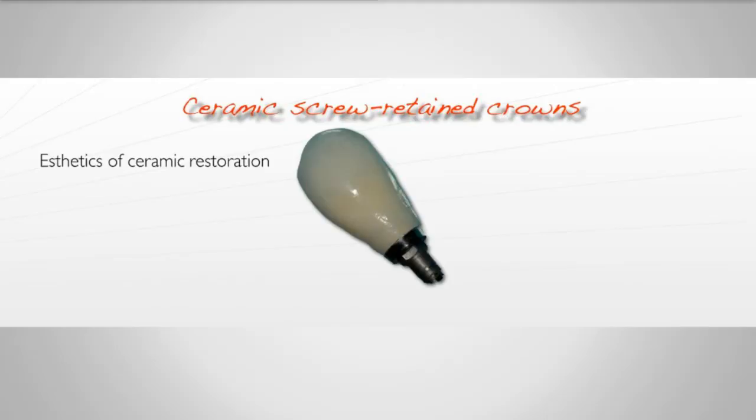If you're making CAD CAM crowns, I simply still like the aesthetics of hand-applied porcelain, so we're just getting the core made with the CAD CAM procedure. These are not UCLA abutments. They are, gosh, a good question, Stuart. They're titanium. They might be titanium bases from temporary cylinders, but I'm not absolutely sure. But it's a procedure that my lab is using. All right, so we've got the aesthetics of a ceramic restoration.